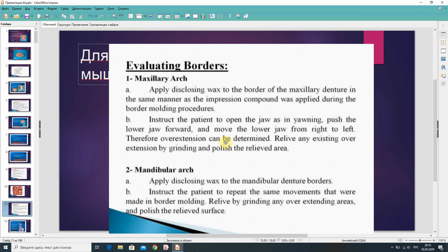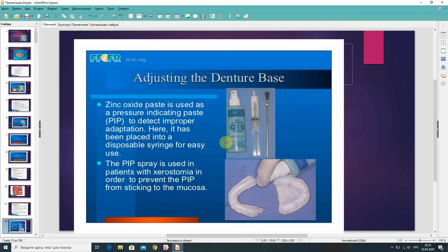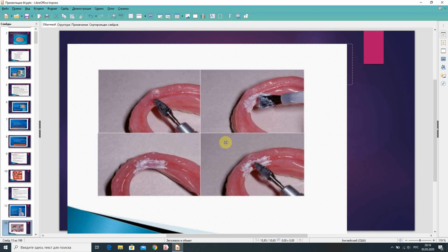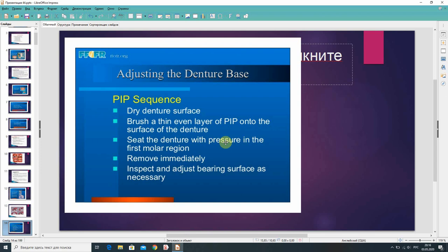For adjusting the denture base, zinc oxide paste is used as a pressure indicating paste to detect improper adaptation. It can be placed into a disposable syringe for easy use. PIP spray is used in patients with xerostomia to prevent the PIP from sticking to the mucosa. The PIP sequence is: dry denture surface, brush a thin even layer of PIP onto the surface of the denture, seat the denture with pressure in the first molar region, remove immediately, then inspect and adjust bearing surface as necessary.